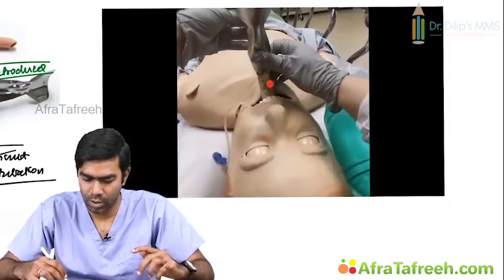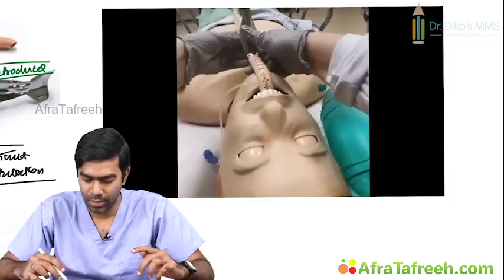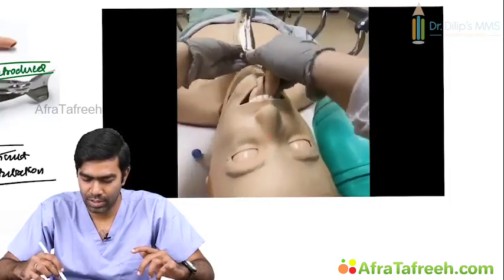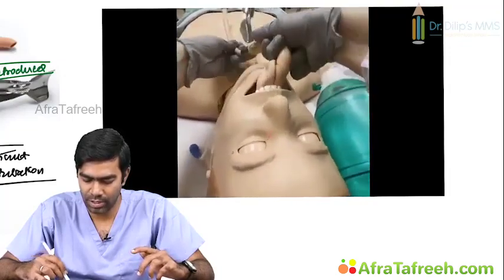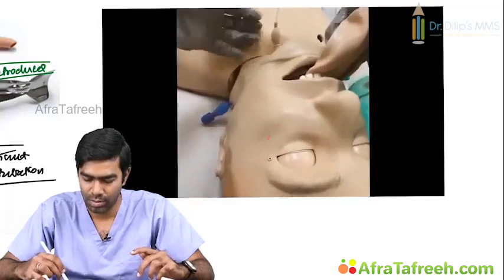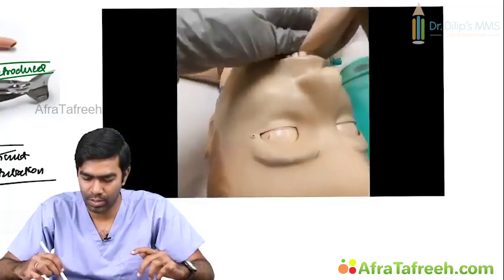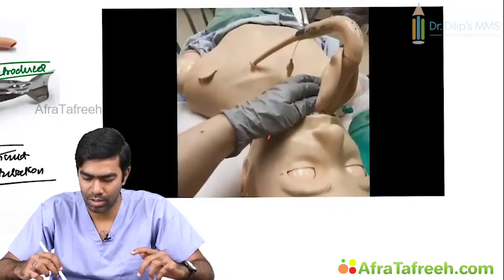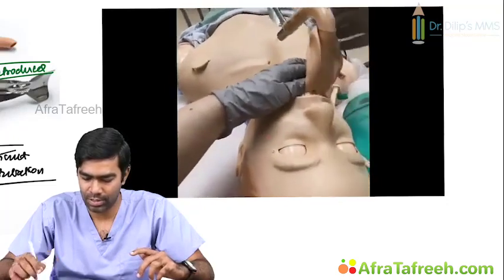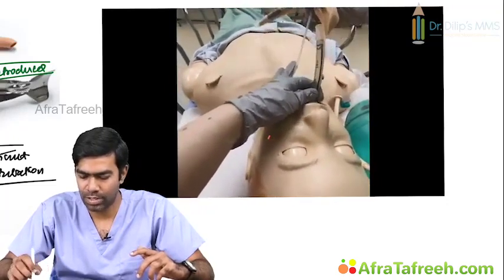Yes, slowly you can remove the LMA after deflating the cuff. So once you see the endotracheal tube in your eyes, you grab and hold the endotracheal tube. Yes, you grab and hold the endotracheal tube. Now remove the LMA and the stabilizing rod. That's it. So now your intubation is done.